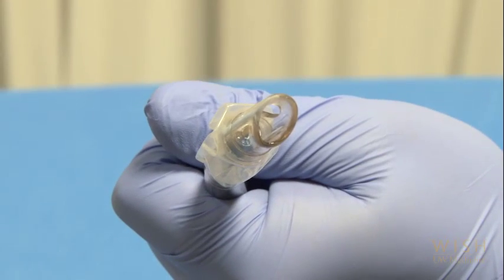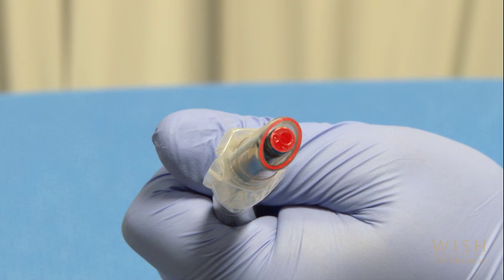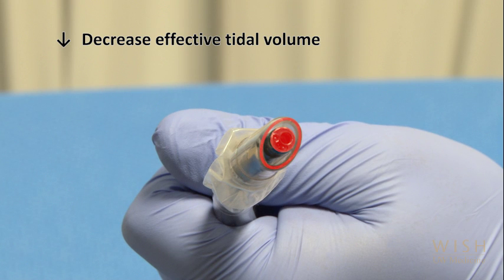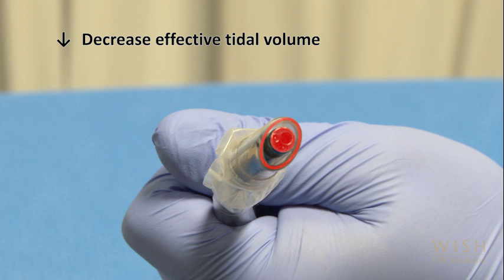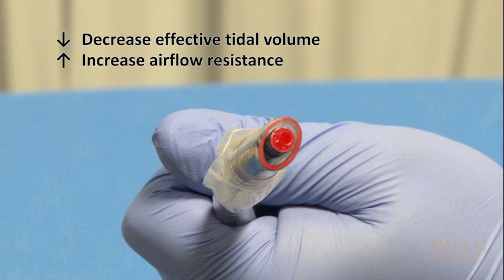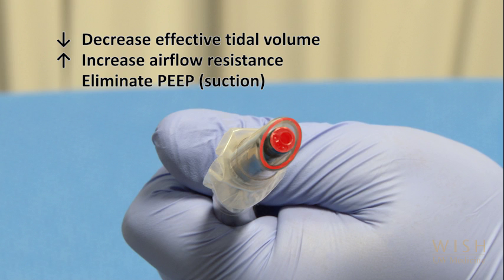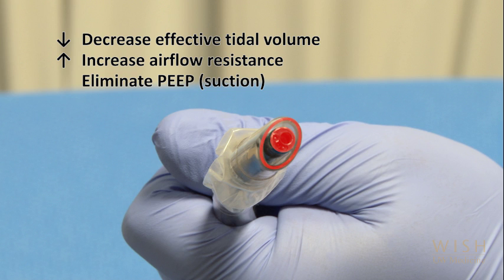Inserting the bronchoscope into the endotracheal tube will cause a dramatic decrease in the effective diameter of the endotracheal tube, reducing the effective tidal volume administered by the ventilator. The upper airway narrowing caused by the bronchoscope will also increase airflow resistance during the expiratory phase, potentially resulting in increased intrathoracic pressure from incompletely exhaled tidal volumes. On the other hand, positive end expiratory pressure, or PEEP, which may be essential for adequate oxygenation, can be eliminated by vigorous bronchoscopic suctioning, resulting in desaturation, and this should also be avoided.